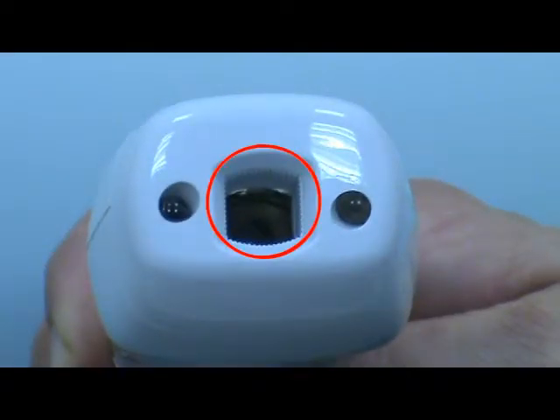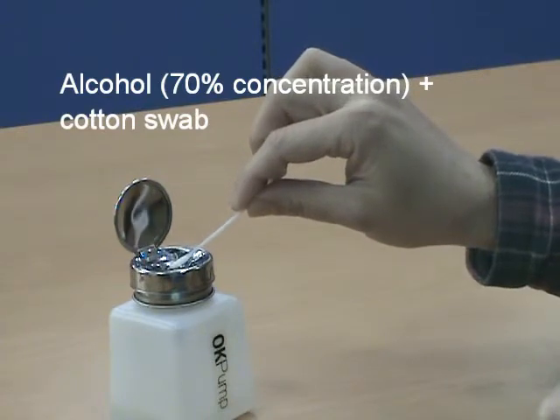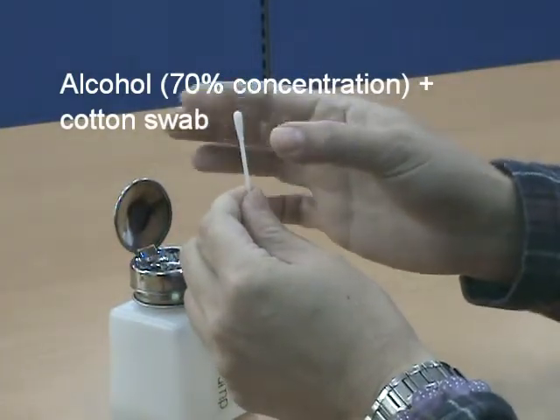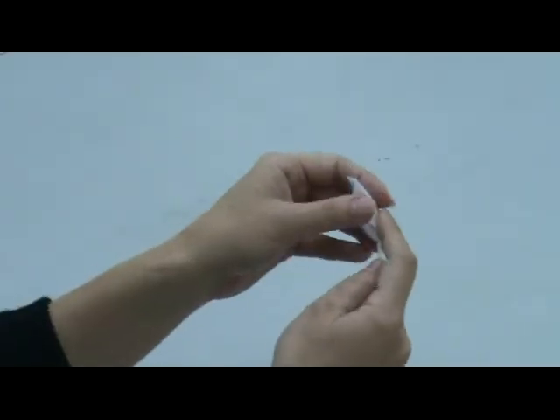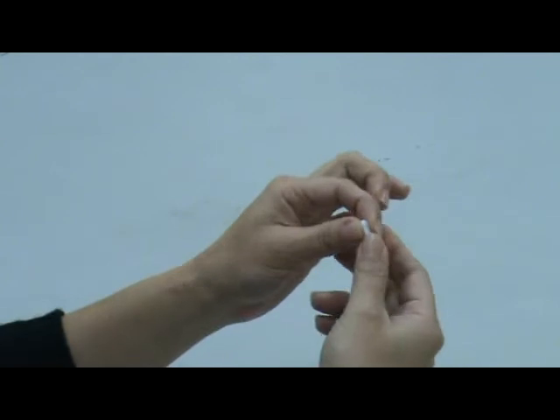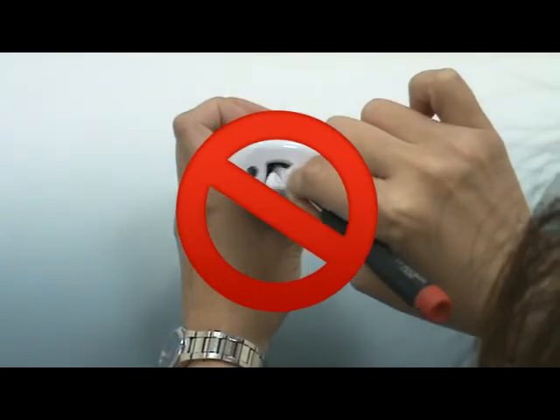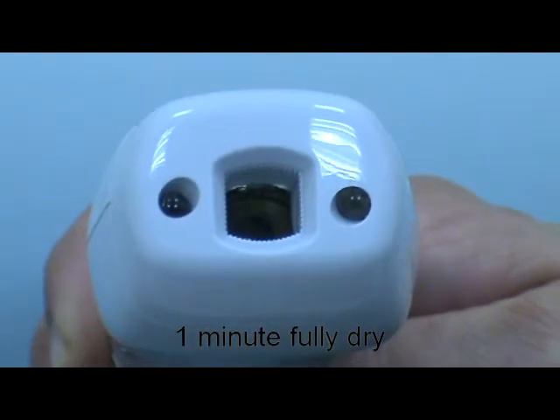Please make sure the probe is clean to ensure an accurate reading. The probe lens is the most delicate part of the thermometer — use care when cleaning to avoid damage. Use a cotton swab with 70% concentration alcohol to clean the probe. Slightly squeeze the cotton swab to remove excess alcohol. If 70% alcohol is unavailable, use an alcohol prep pad. Do not use a sharp object to wipe the lens. Allow the probe to fully dry for at least 1 minute.